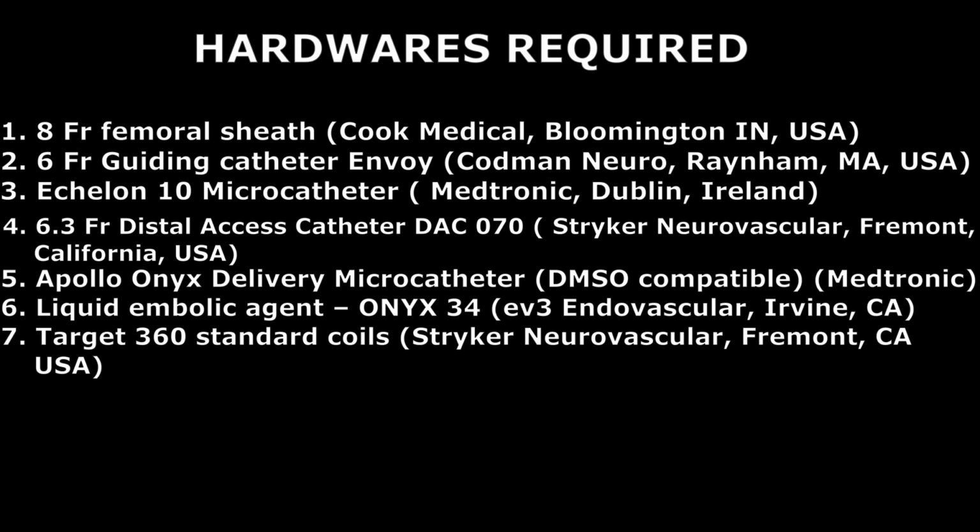These were the hardware required for the procedure. An 8 French femoral sheath, a 6 French Envoy guiding catheter, a 6.3 French distal access catheter DAC 070, one Apollo Onyx Delivery microcatheter, an Echelon 10 microcatheter, liquid embolic agent Onyx 34, and Target 360 standard coils.